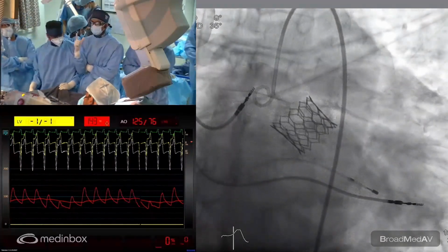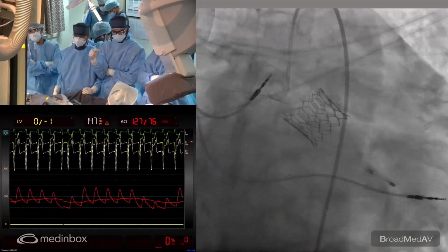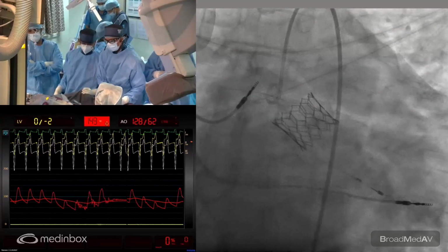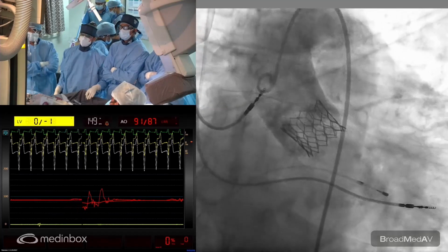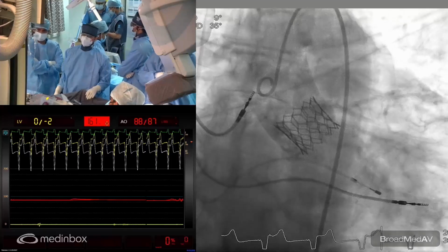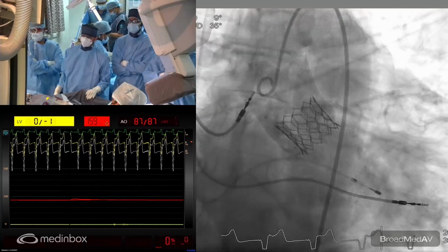So let's take a cine and see if the left coronary is coming just in between these commissures on the right side of our screen. One cine please. Ready? No need to aspirate. Ready? I think it looks like the commissural alignment is there, plus or minus 15 degrees. So you're happy with that commissural alignment?